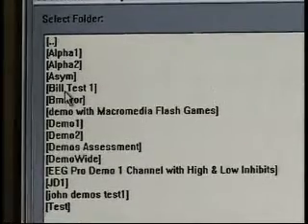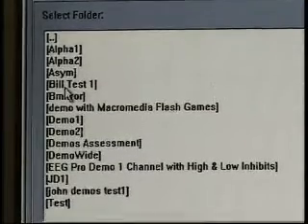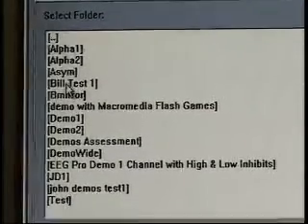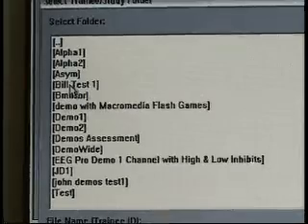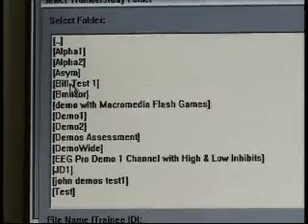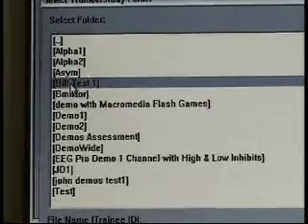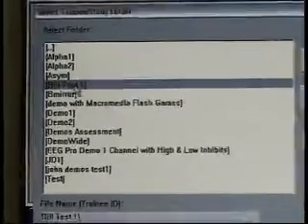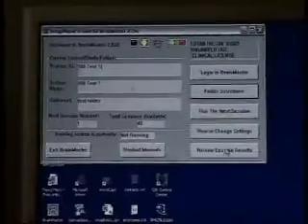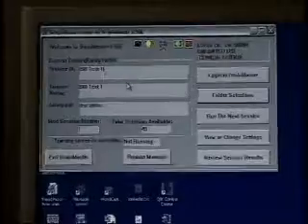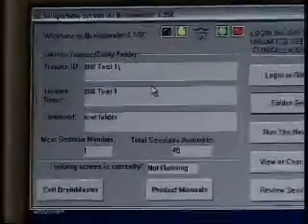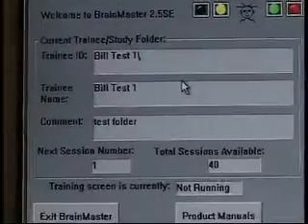When a client comes in next time, you would simply open Select a Folder, highlight their name, hit OK, and it would load their folder and they'd be ready to run.